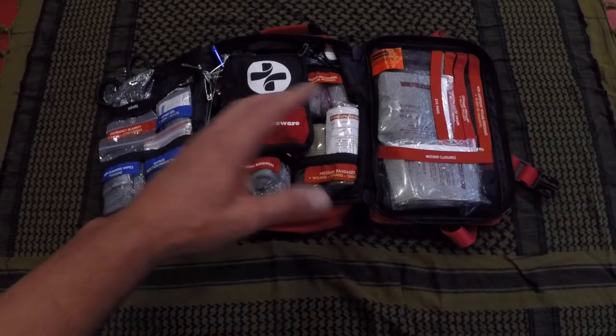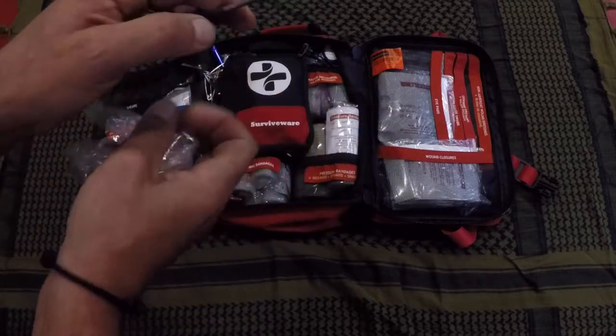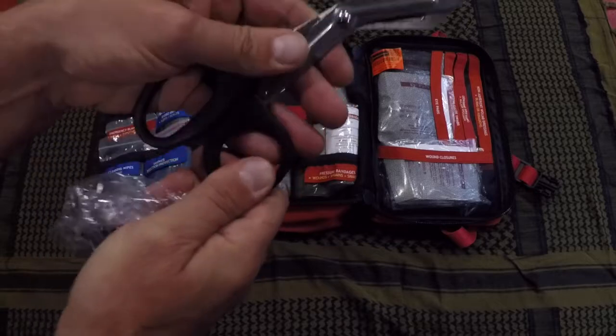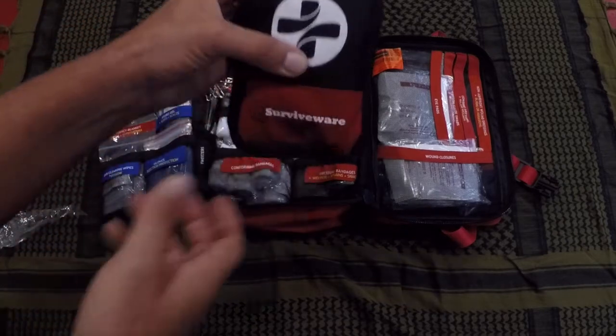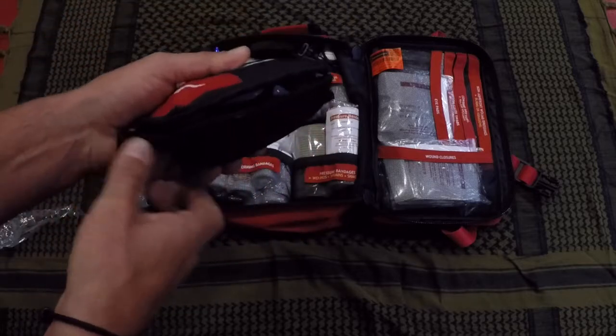As you can tell, there are a ton of items in here. Even looking at the shears, they are stainless steel, good to go — there's consistency to them and they're not going to break the first time you use them. That goes for pretty much all the components in here.